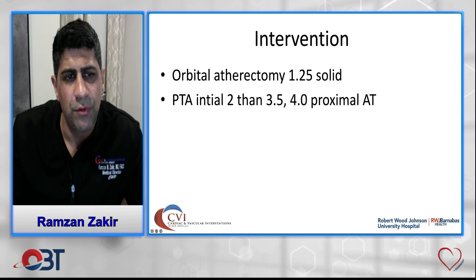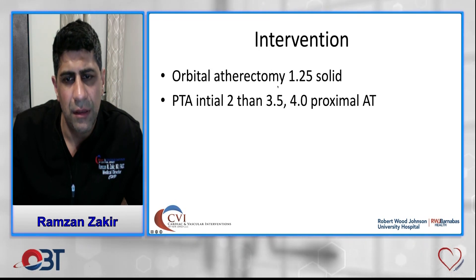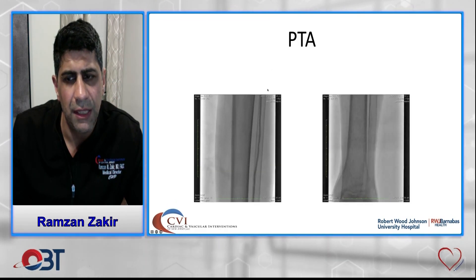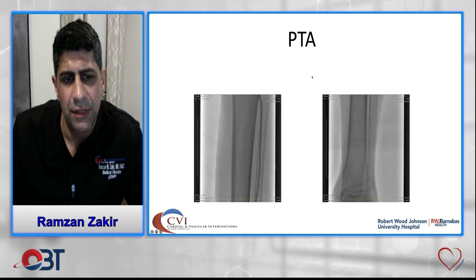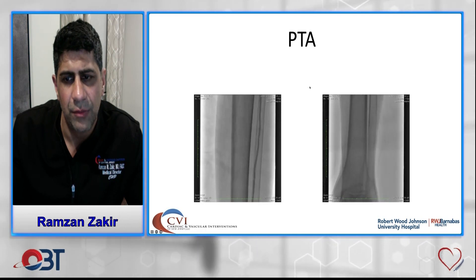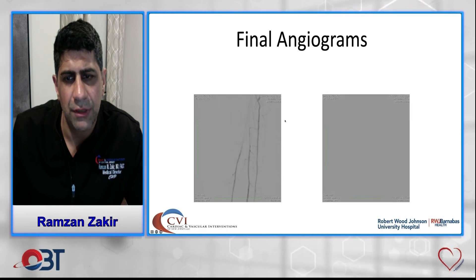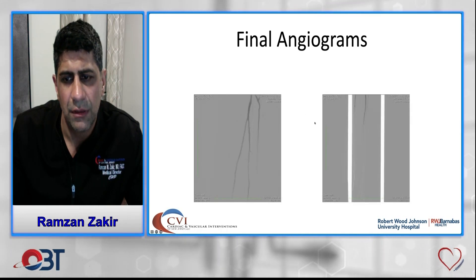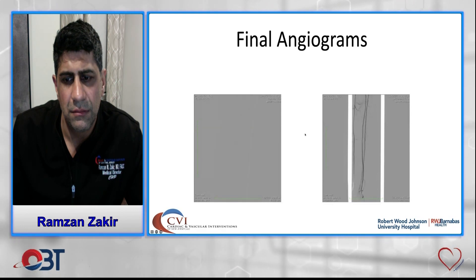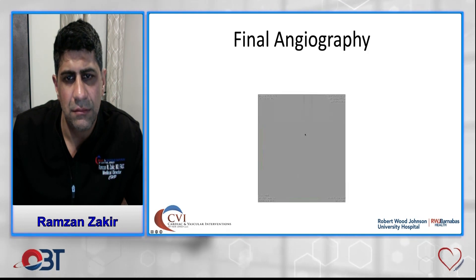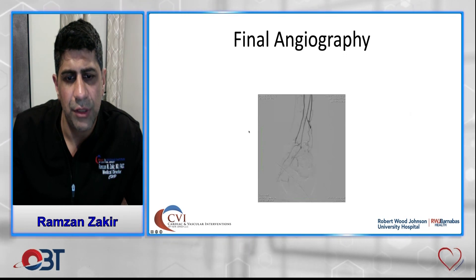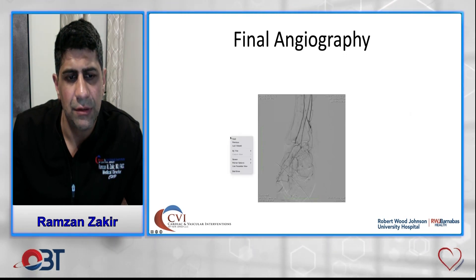We externalized the wire, performed orbital atherectomy, then sequential PTA. You can see a nice balloon inflation without a waist, and a very nice final result in the anterior tibial artery with good blush into the toes.